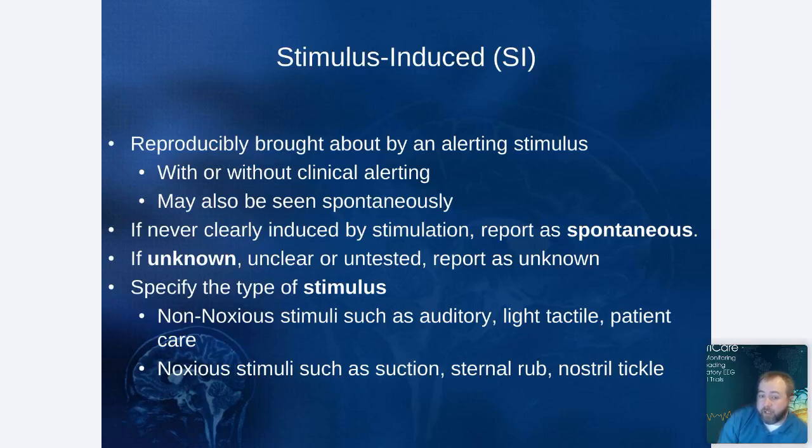It may also be seen spontaneously. If never clearly induced by stimulation, reported as spontaneous. If it's unknown, unclear, or untested, reported as unknown. Make sure you specify the type of stimulus. So it could be non-noxious stimuli, such as auditory, light tactile, patient care, or noxious stimuli, such as suctioning, sternal rub, or nostril tickle.